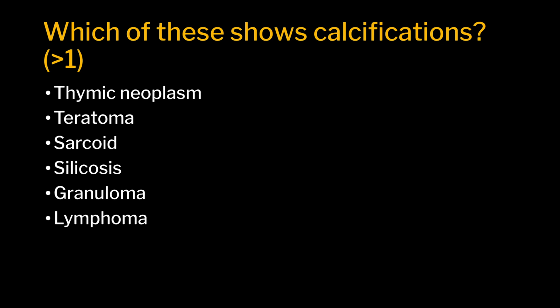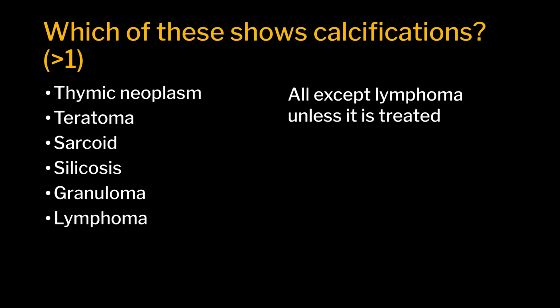So which of these shows calcification? These are all diseases that you can have in the mediastinum. Which of them will show calcification? You can choose more than one. So the answer is actually all of them can show calcification except for lymphoma, unless it's treated lymphoma, in which case that can also be calcified as I just showed you.